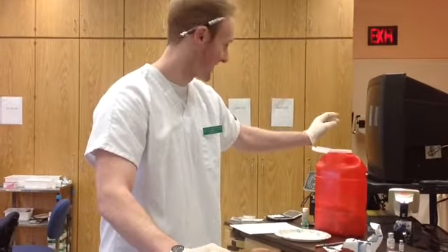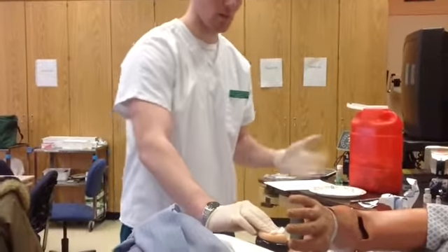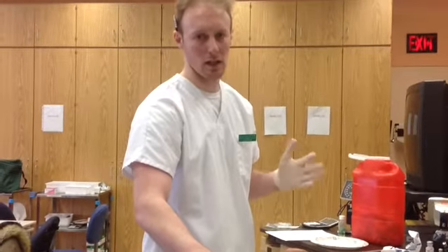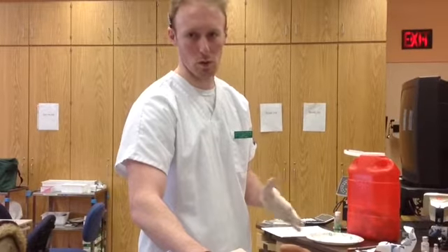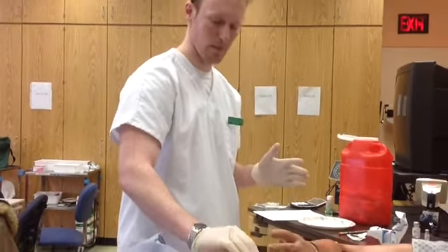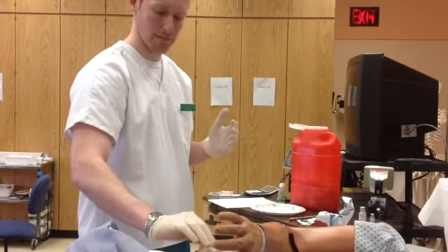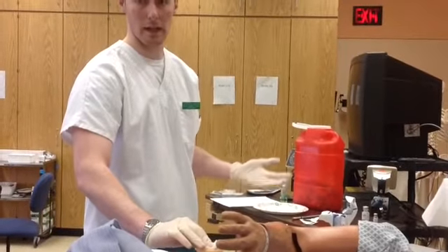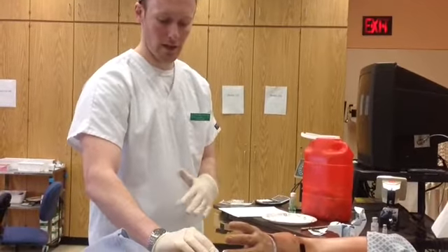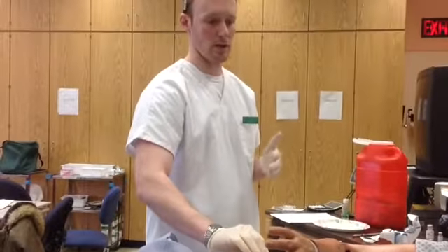No hand passing. I'm going to apply pressure and also ask the patient if he would like a cold or warm compress for any pain relief, any discomfort, and I will also tell him that I'm going to come back in to reevaluate his site, make sure that there's no signs of infection, no signs of symptoms, no redness, no discomfort.